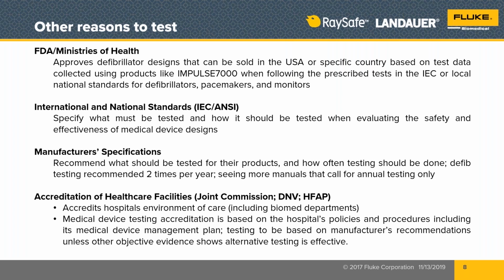Joint Commission International outside the United States, DNV, which is also international, and HFAP, which is the Healthcare Facilities Accreditation Program, that is going to audit how we are doing the testing on these medical devices and more. So it's important to you. Let me give you one more reason why.